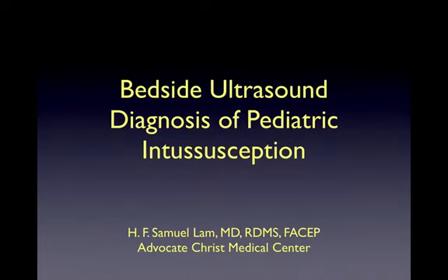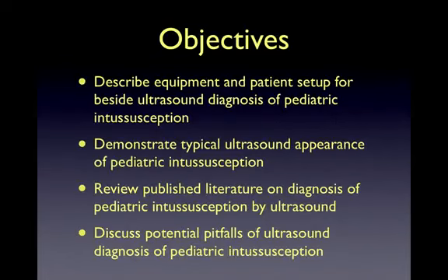Hello, my name is Sam Lam, and the title of the lecture is Bedside Ultrasound Diagnosis of Pediatric Intussusception. And here are the objectives of the lecture.